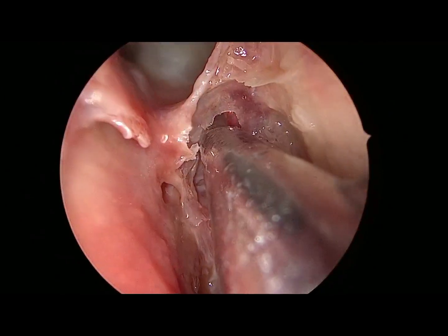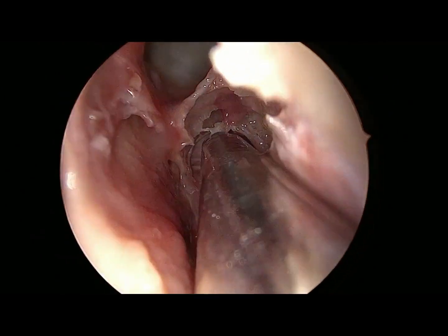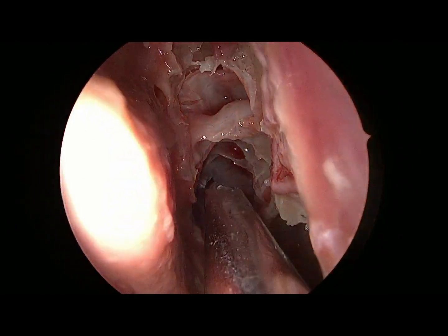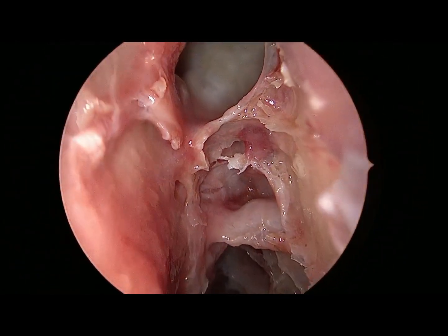So now once I identify the frontal drainage pathway, the next step is to identify the anterior ethmoidal artery. Anterior ethmoidal artery forms one of the boundaries for the frontal sinus.